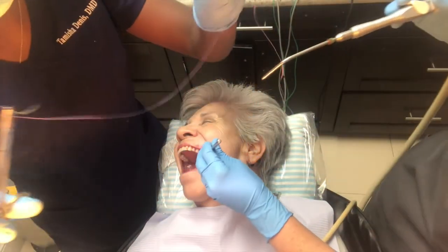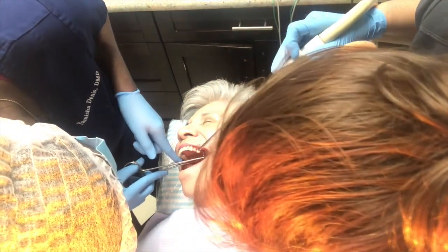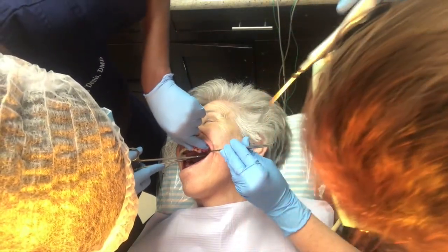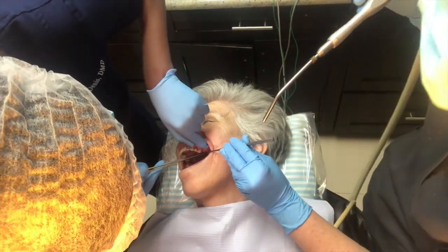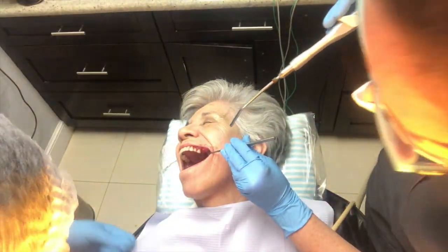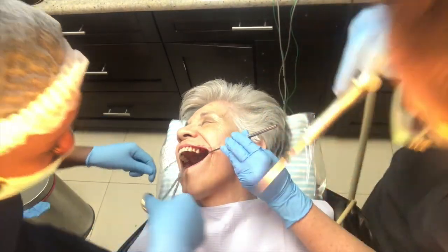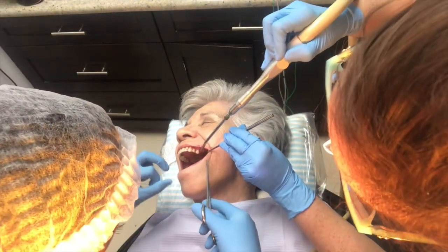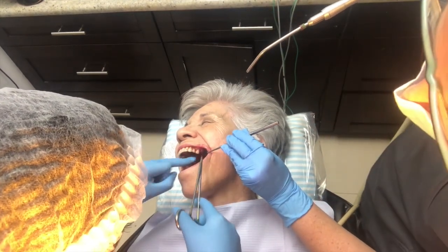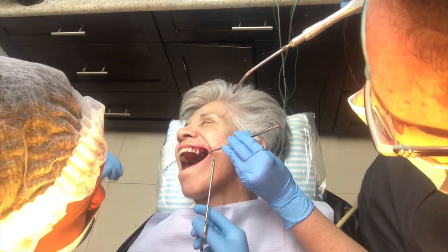If you see here, I'm holding up the suture. With the suture, we're going to suture the area closed. Remember, I opened up a flap, so our gums are a little bit open. I like to use non-resorbable sutures when I'm placing implants because I would like the sutures to hang out as long as possible. So during the healing, everything stays nice and closed, the bone stays nice and protected and in place, and basically the elements of eating and drinking cannot affect the implant.